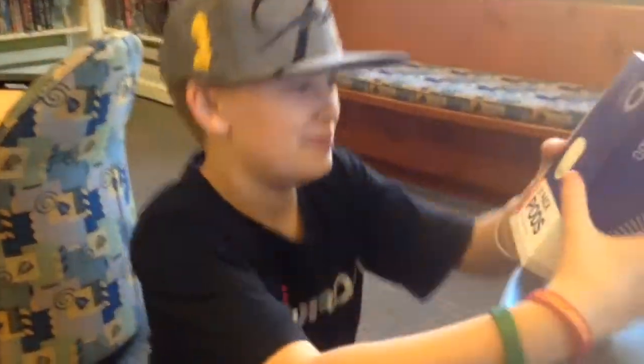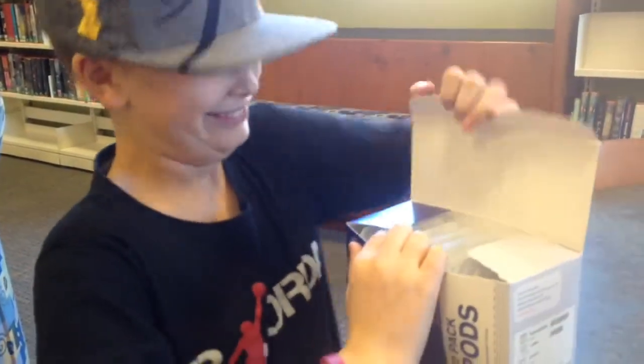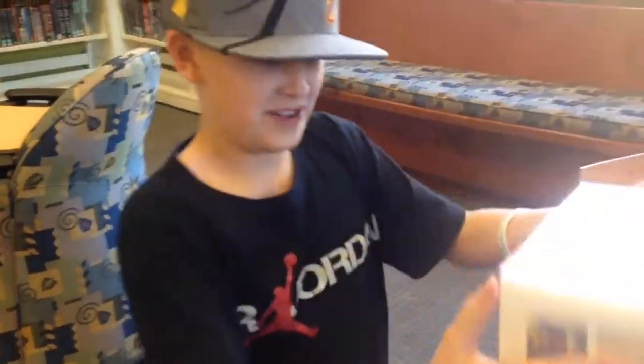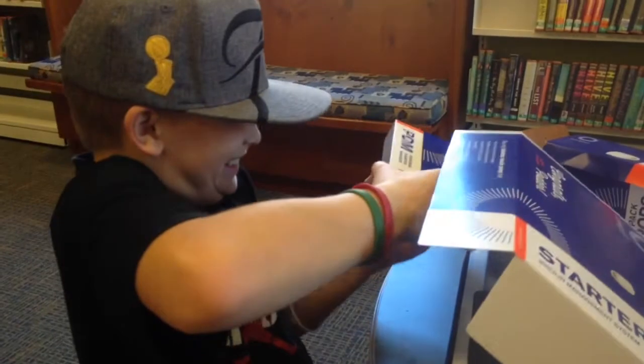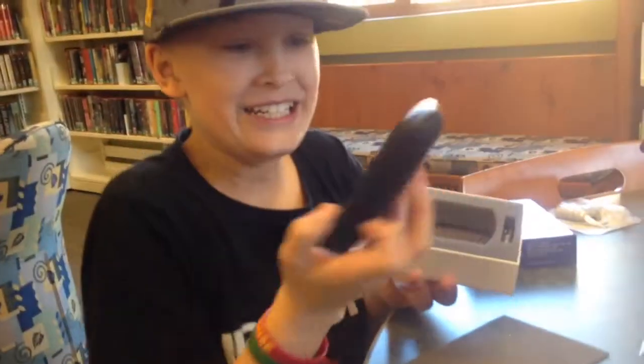The Omnipod lady's not here yet, but we're still gonna get out our stuff. We're gonna open up the Omnipod pack — this is gonna be our Omnipod. Here we have our PDM. Here's my insulin, and these boxes are filled with the insulin that we're gonna put in the Omnipod.